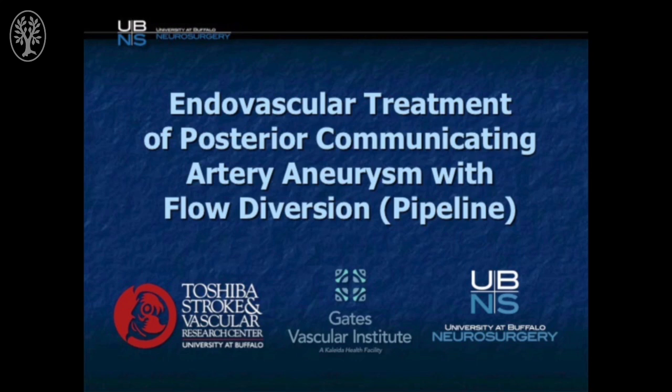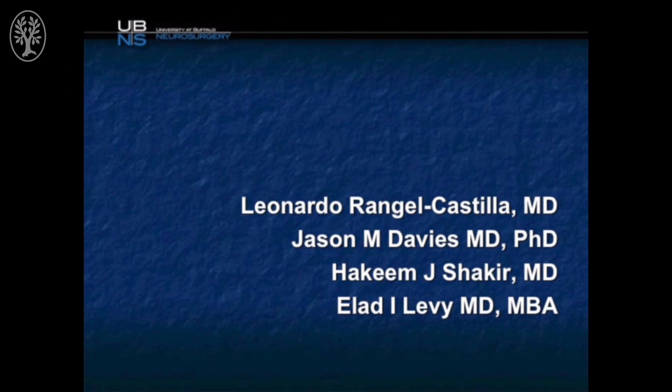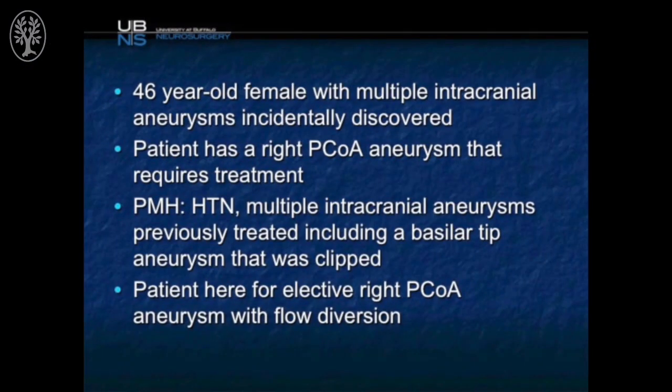This is a case of endovascular treatment of a posterior communicating artery aneurysm with flow diversion. This 46-year-old female presented with multiple intracranial aneurysms. The right PCOM aneurysm is currently planned for treatment. Prior history includes clipping of a basilar tip aneurysm.